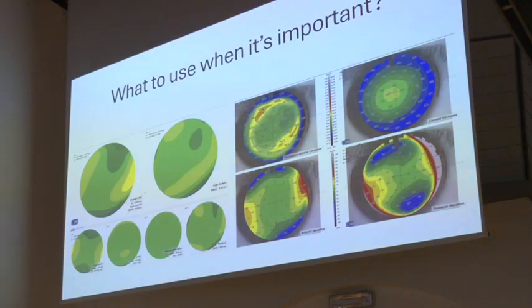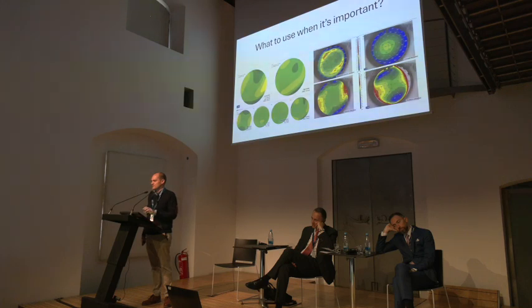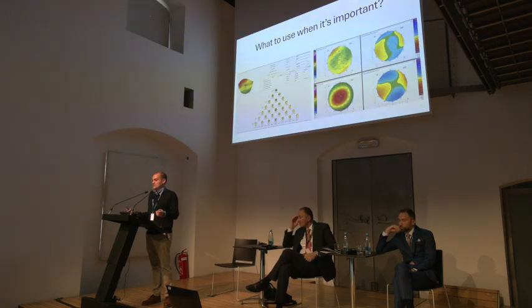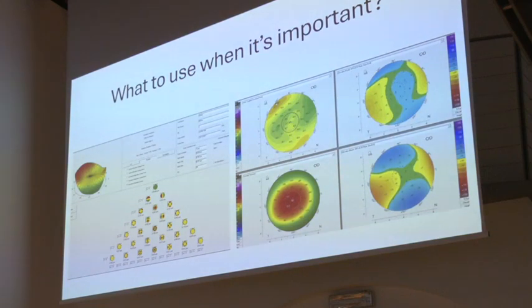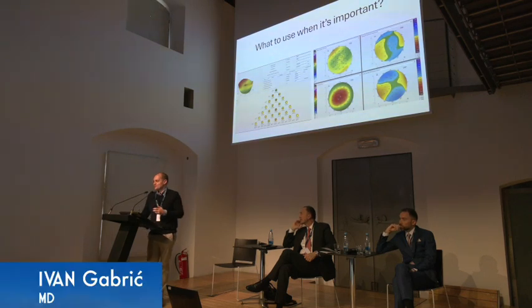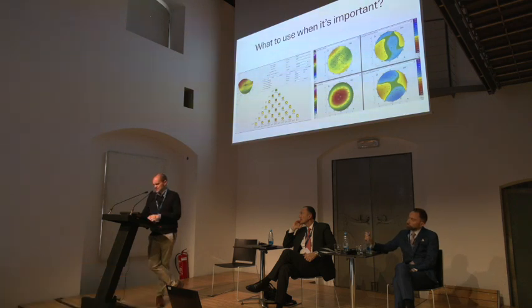But what would you use when it's important? This is a scan from MS-39 and the aberration report on MS-39 and the CSO software versus the same report from the Scheimpflug thing. Well, this was actually my father's eye. He had LASIK for oblique astigmatism, and there was a discussion in our clinic, what lens should we implant? And my colleague who believes in Pentacam said, no, we can't put any sort of premium lens inside. Look at the Pentacam, look at the aberrations, look at everything. It's never going to work.